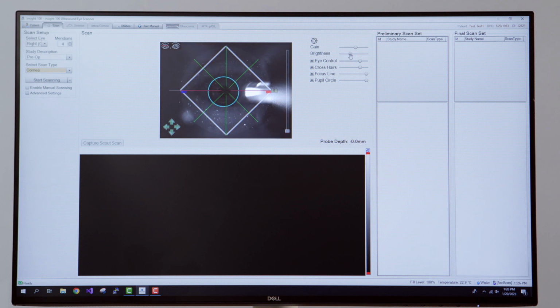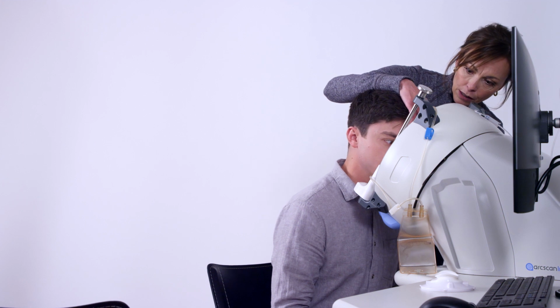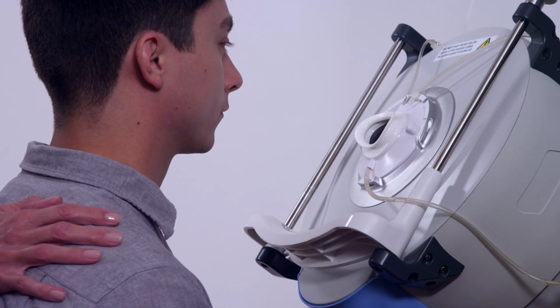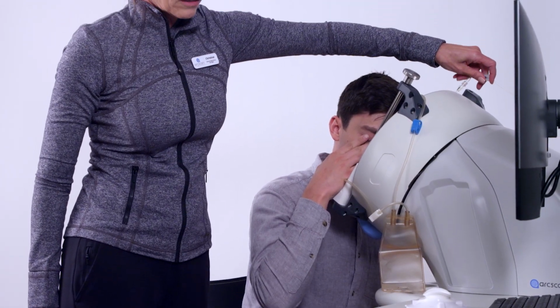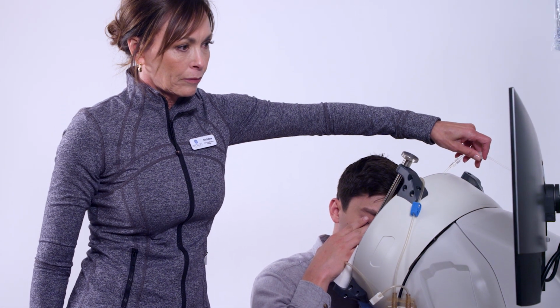In the camera view, also take note of the eyelids. One of the most important tips for getting good images is having the lids open as wide as possible. You may have to help your patient open the lids. As you guide the patient in, watch the positioning again in the camera view. Let the patient know that the fixation light should look like a white horizon. Then check for any visible gaps and confirm with the patient that they feel like they have contact all the way around. Once the patient is well positioned, release the saline into the EyeSeal by opening the line here.